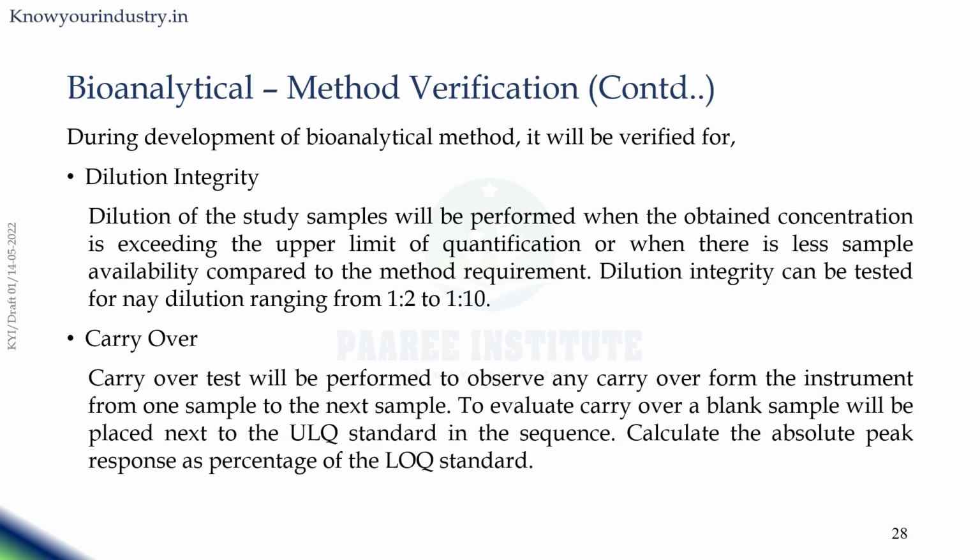So to evaluate the carryover, a blank sample will be placed next to the ULOQ standard in the sequence. Calculate the absolute peak response as a percentage of the LOQ standard. So you are going to inject the largest concentration, followed by a blank sample, and there should not be any drug concentration in the blank sample when it is injected next to the highest concentration. Hence, it proves that there is no carryover of the drug during the subsequent injections.